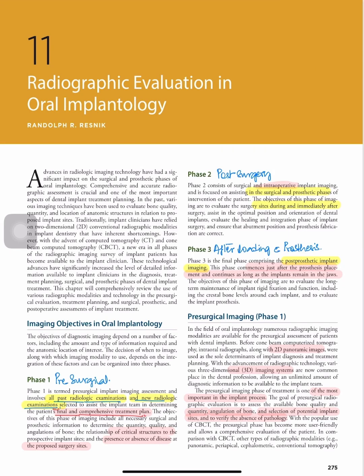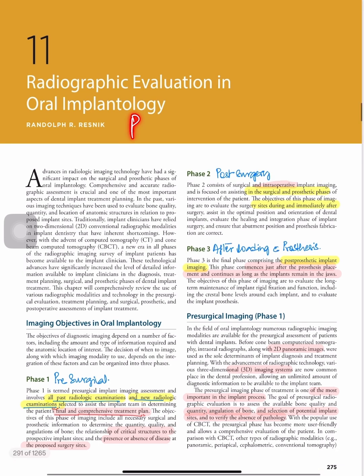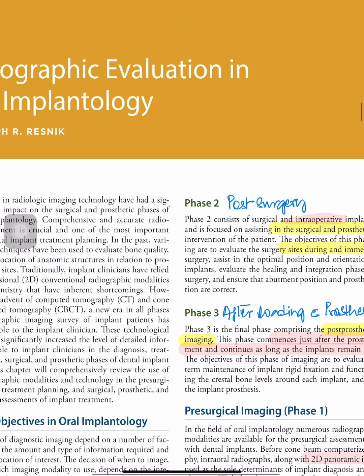So, hi everyone. As a part of our lecture series on contemporary implant dentistry, this is video 2 of the series. Basically, in this chapter, we will be covering the radiographic assessment before and after implant surgery. We won't be talking about the planning part, but rather we will introduce you to the various modalities that we use for evaluation. We will talk about normal anatomy, anatomical variation, and certain pathology.